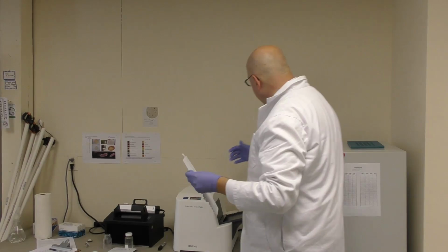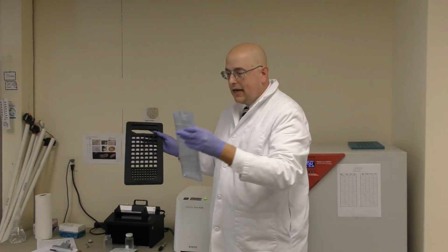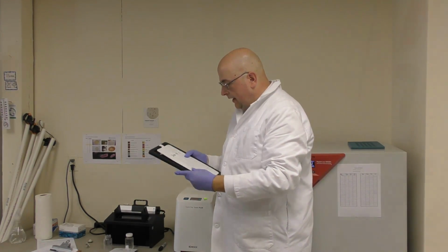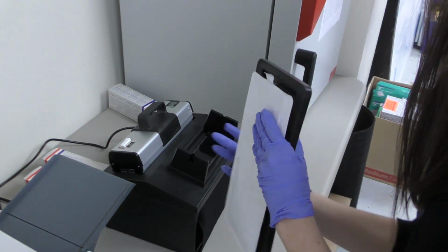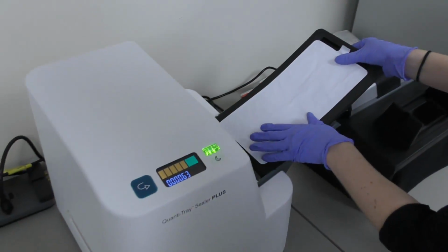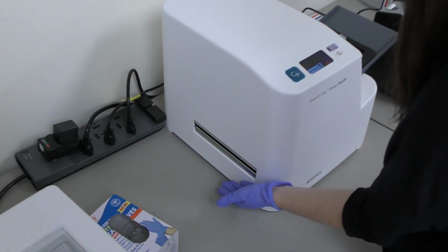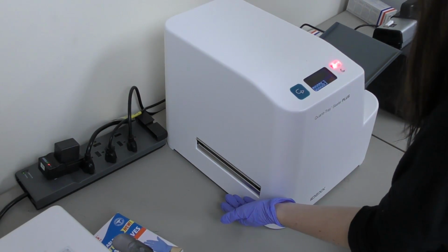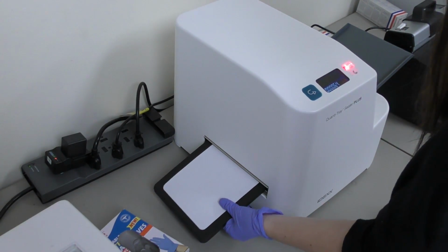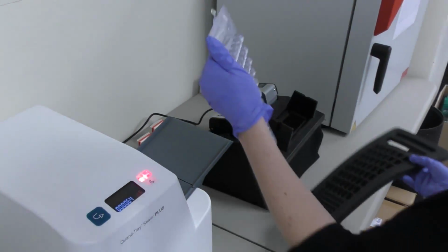Okay. Then what happens is you take this tray sealer, and you'll notice it has the same indentations as the Quanta tray, so this is the Quanta Tray 2000 sealer tray. And you basically just lay that tray in there until it fits. So once you've got your tray prepared, you place it in this input tray right here, and you just push it in until it grabs it, and it's going to run it through the sealer. And you want to have your hand on the other side to get it. And you pull it out, and now the sample is sealed.